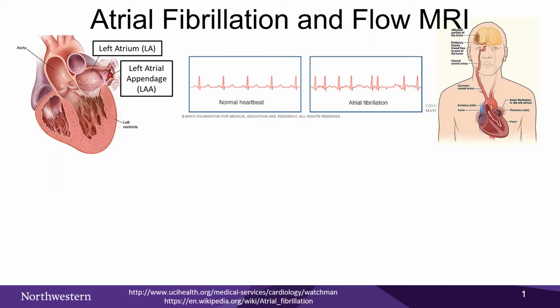Atrial fibrillation, or AF, is the most common sustained cardiac arrhythmia, where normal cardiac rhythm is disrupted, leading to slow flow hemodynamics that may lead to clot formation and possible stroke. Cardiac MRI has the potential to measure atrial flow biomarkers, which may aid in treating these patients.